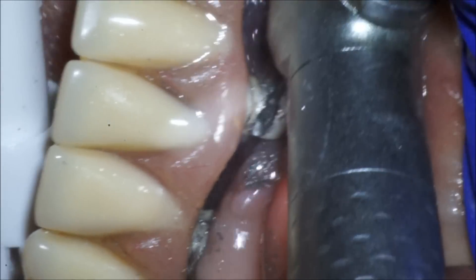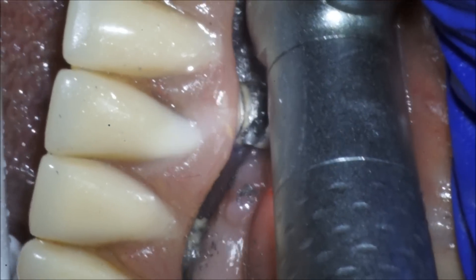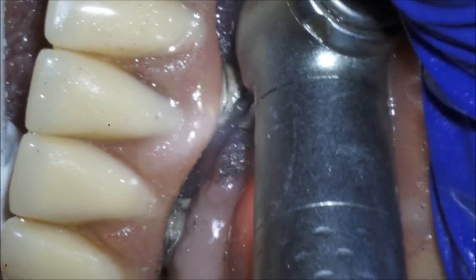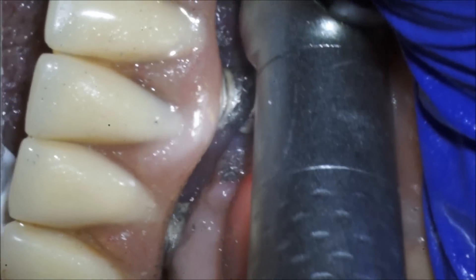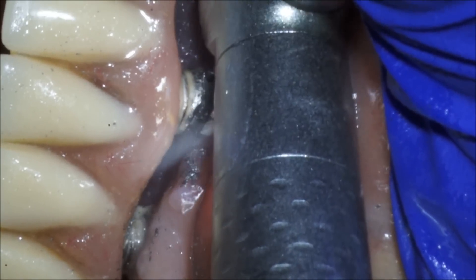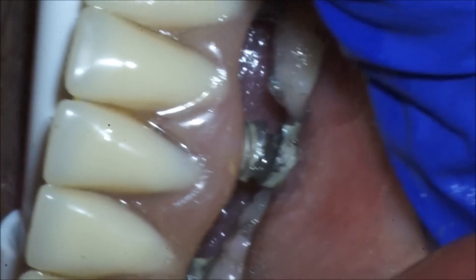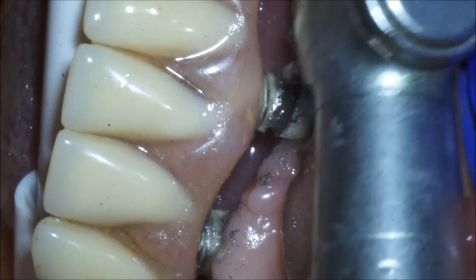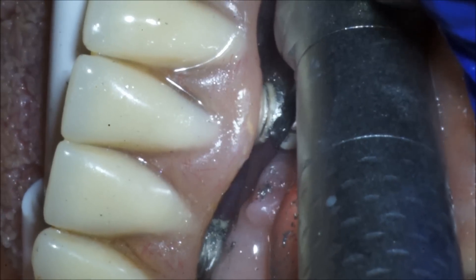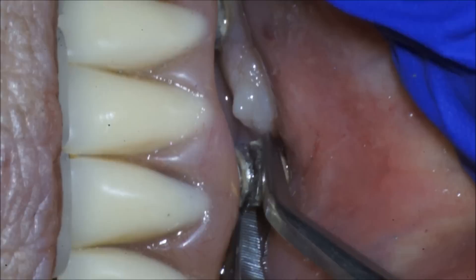The way we've chosen to remove it is to section it in half. By sectioning it, we'll be able to remove it buccally without needing to remove the prosthesis. The patient told us this prosthesis and these implants were placed many years ago, and figuring out what implant system was used and what driver to use — it's just easier to section it in half and eliminate the cause of the infection.